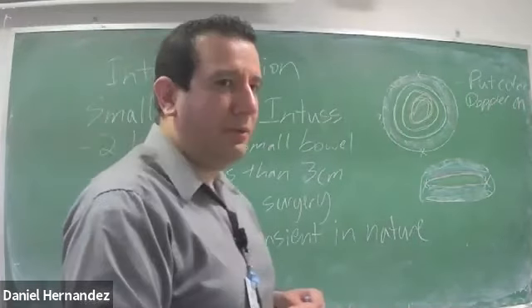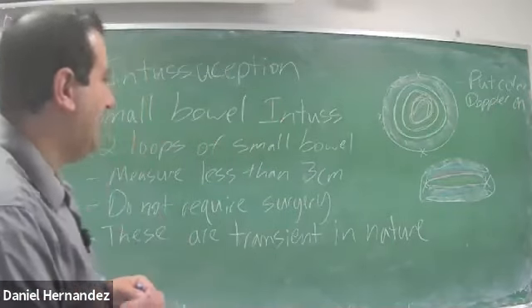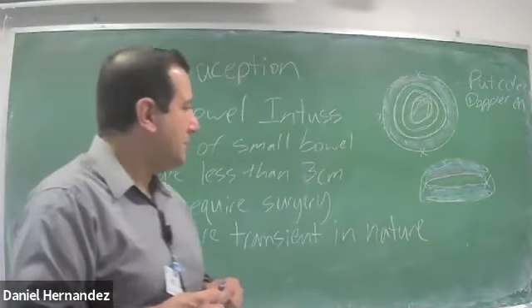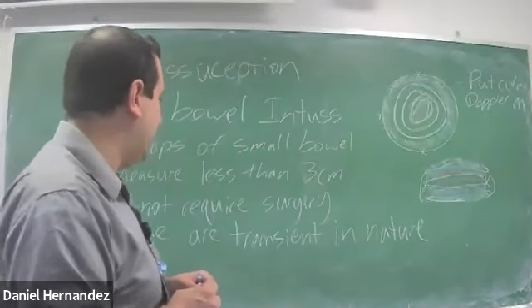But from what I've been told from some of the radiologists, that could be a little misleading. They've had very short segments of intussusception that are very, very difficult to reduce, and then surprisingly very long segments that were quite easy to reduce using that air enema procedure.